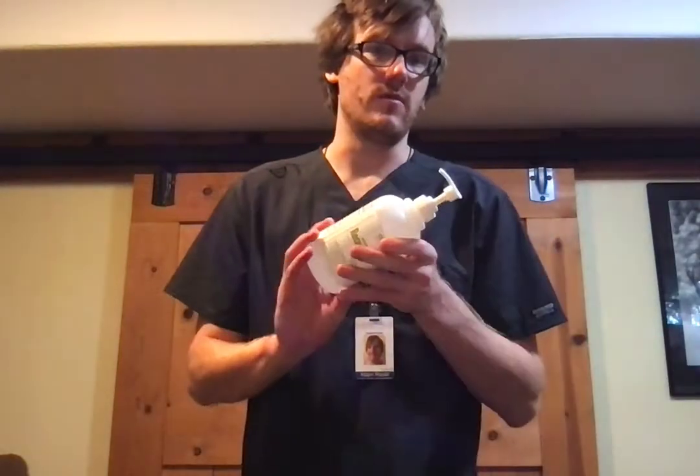This is my BSN205 sterile dressing change submission video. For this, I need a few things. Normally I would use actual hand hygiene, washing my hands appropriately, but I'm just going to use this hand sanitizer for the sake of this scenario and for the sake of time.